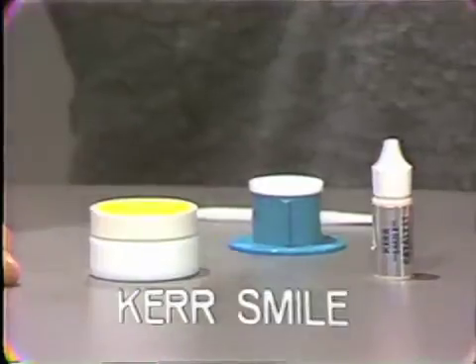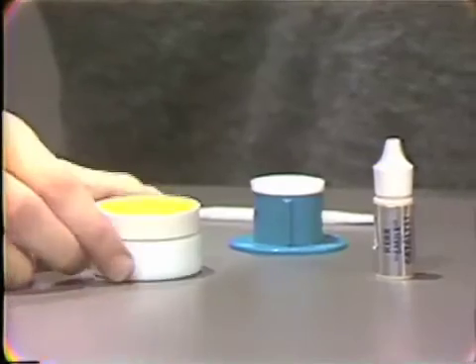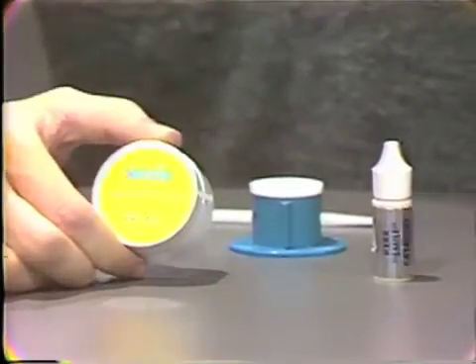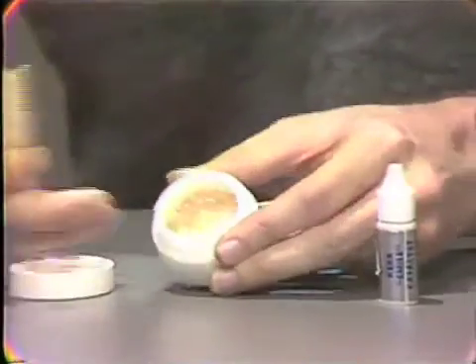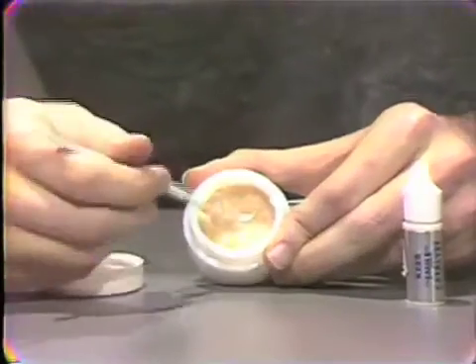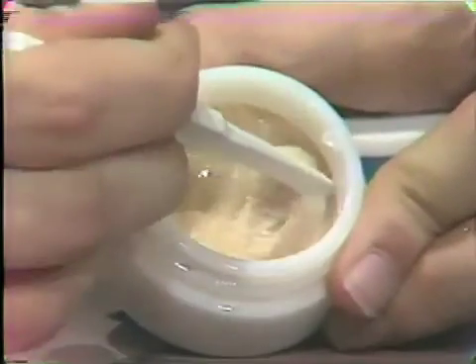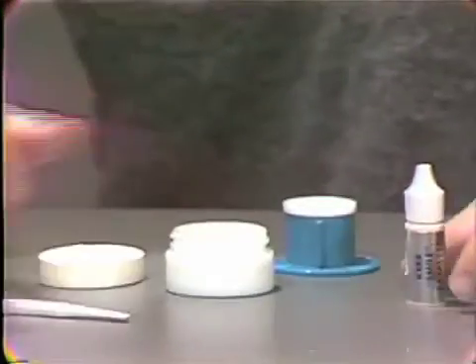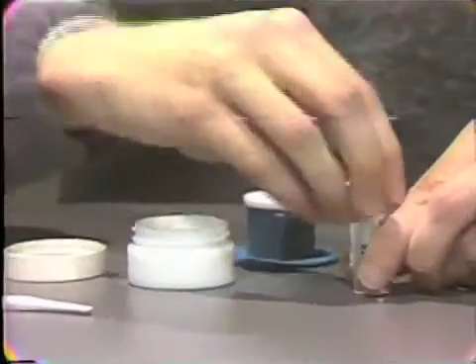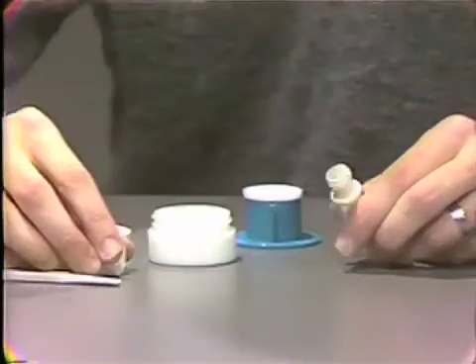Smile, made by the Kerr Company, is a paste-liquid system. The universal shade comes as a paste with a rather thick consistency. The catalyst comes as a liquid in a dropper bottle.